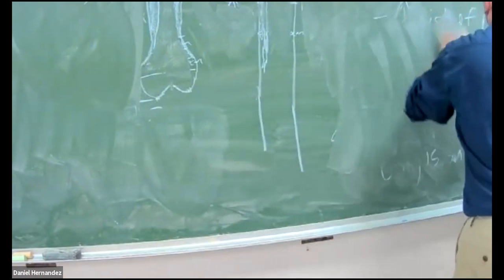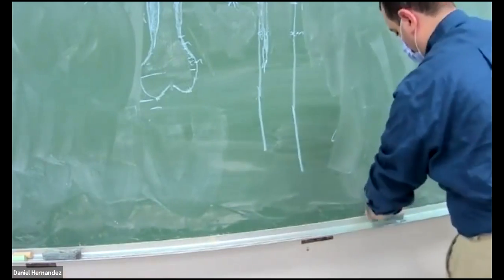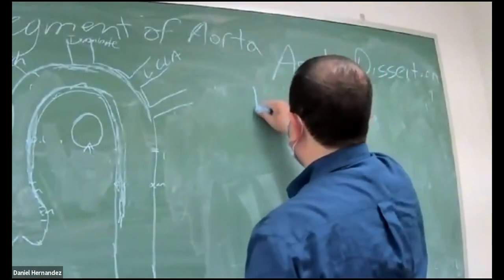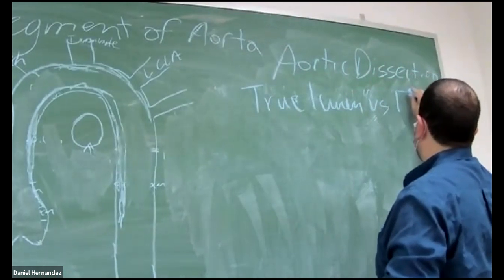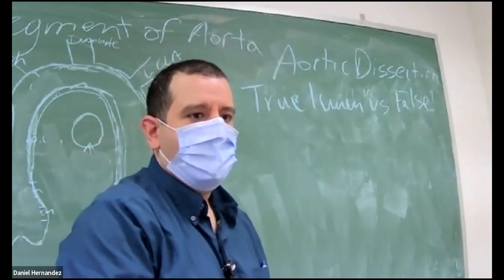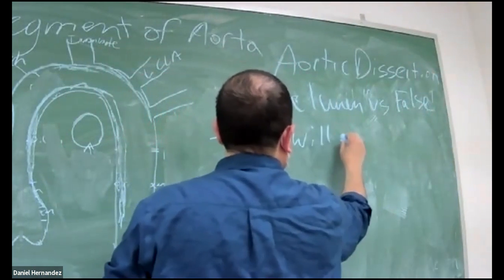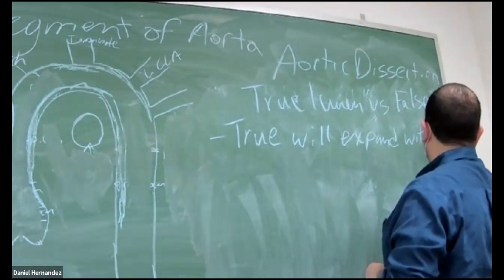All right, so true lumen versus false lumen. True lumen will expand with systole.